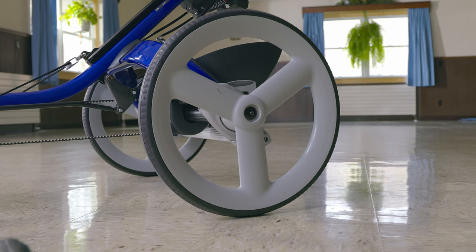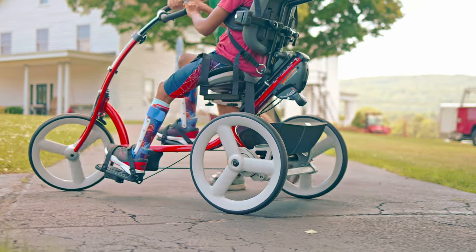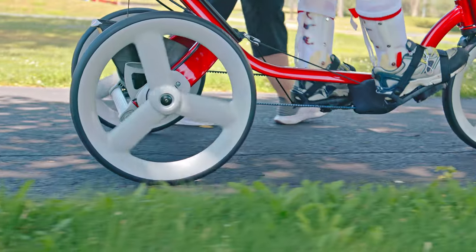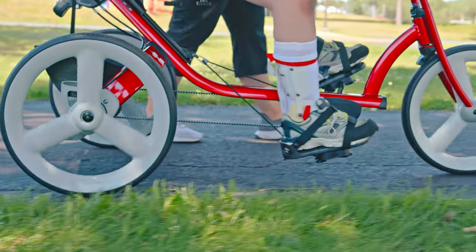The wheels are sturdy and puncture-proof — they're made of solid polyurethane foam. The carbon fiber drive belt will not rust or stretch, is maintenance-free, and will last at least five times longer than a bicycle chain.